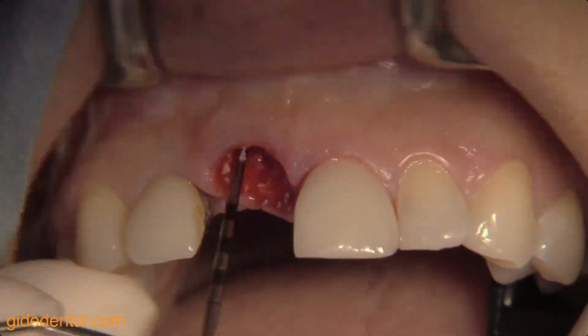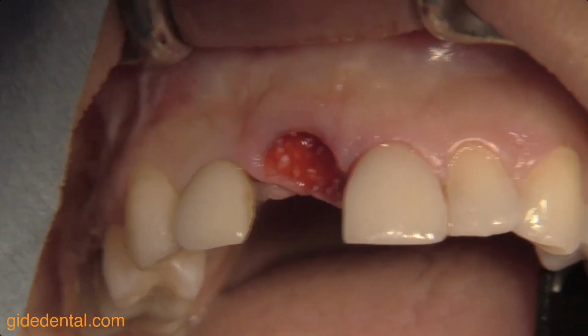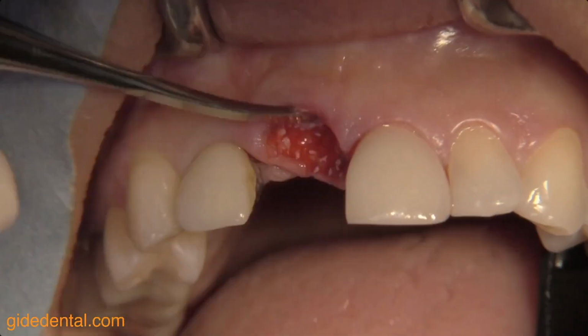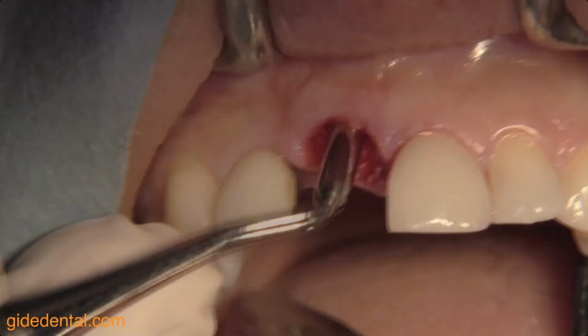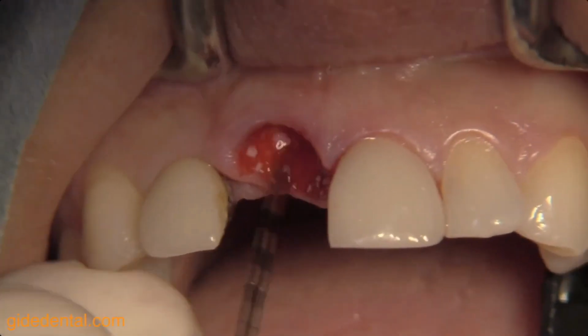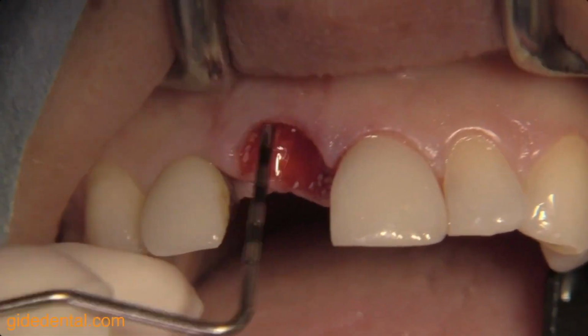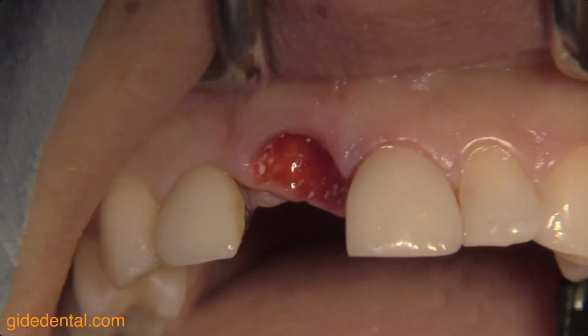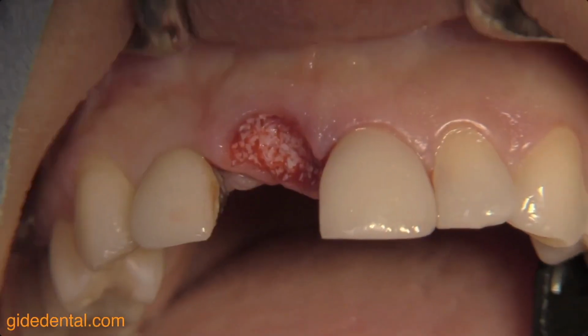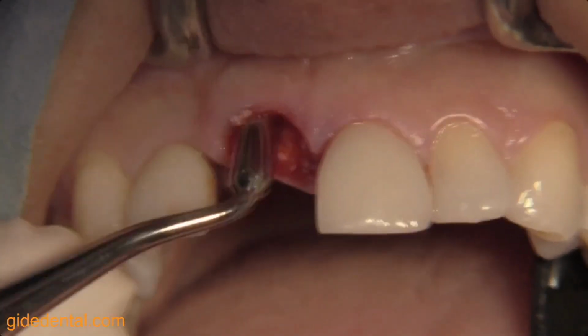And you can see also how the bleeding is occurring at this moment, so that's good. And all the white particles have, of course, now been surrounded with blood. And of course, as the blood vessels will be coming in, they'll be taking advantage of all this particulate, which is porous, and move into this area.